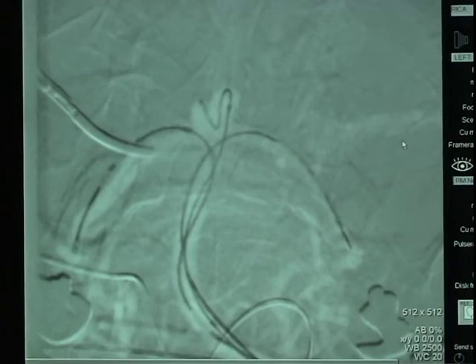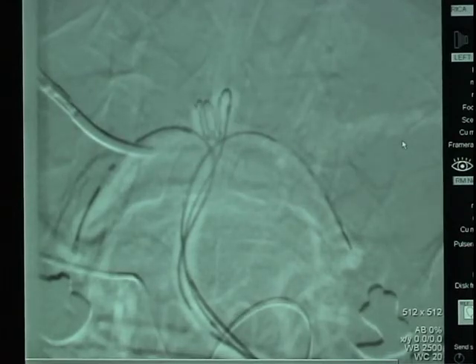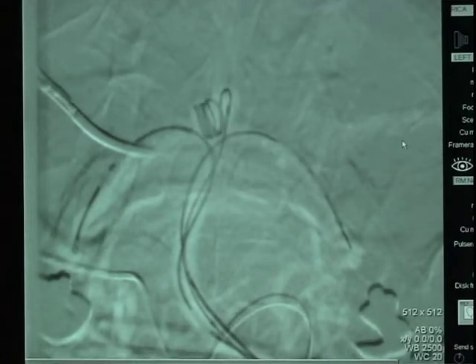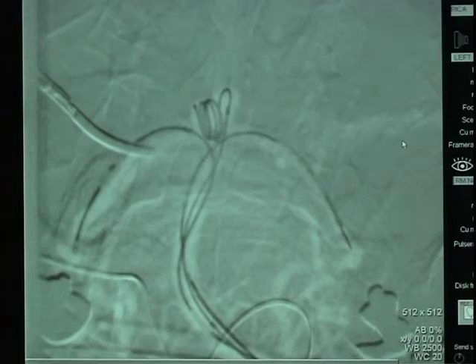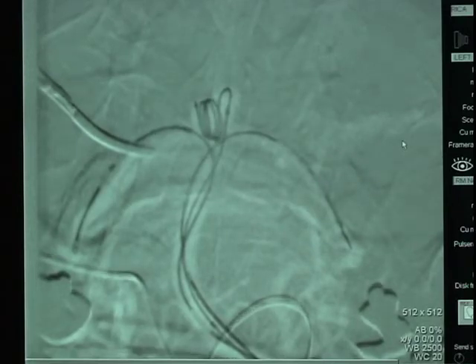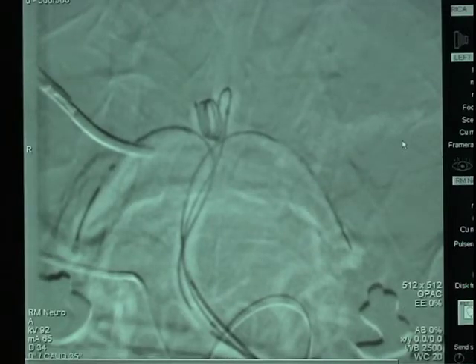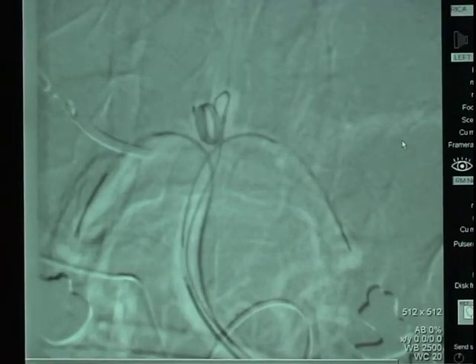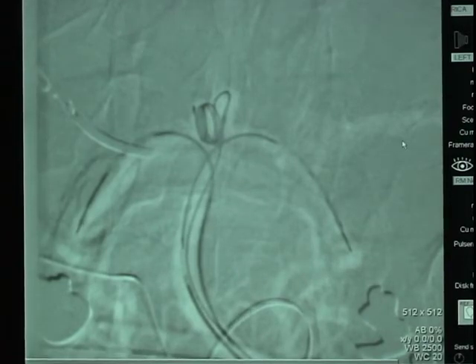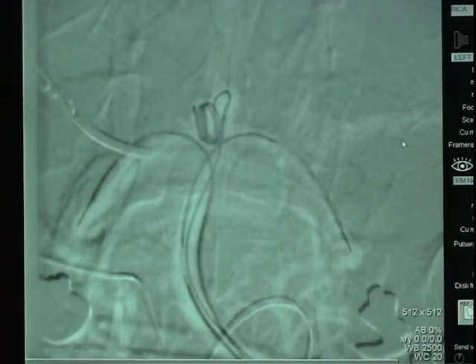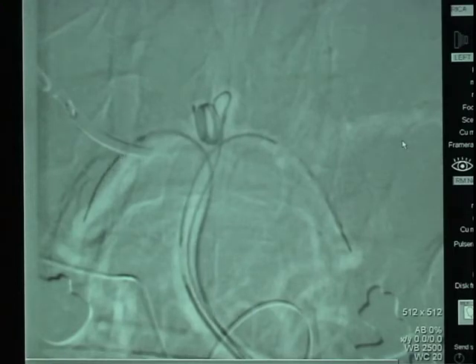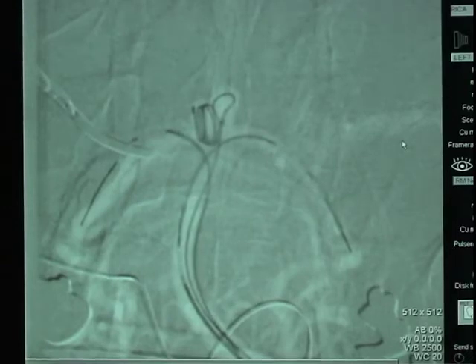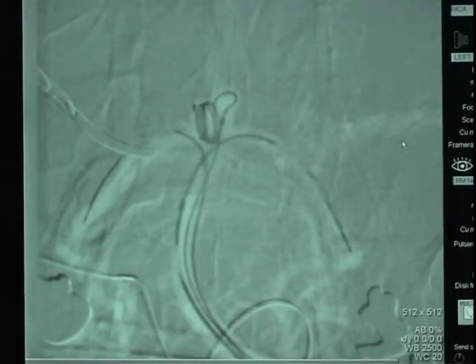A coil is advanced into the aneurysm to hold the microcatheter in position. This anchors the microcatheter as we manipulate the neck remodeling devices. The first neck remodeling device in the right posterior cerebral artery is now being unsheathed and released so that it lies partially within the right posterior cerebral artery and partially within the basilar artery.